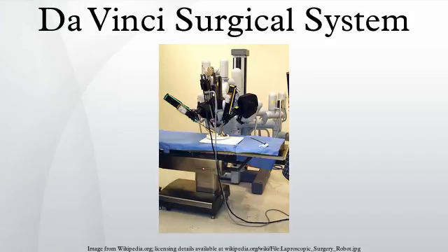Criticism. Critics of robotic surgery assert that it is difficult for users to learn and that it has not been shown to be more effective than traditional laparoscopic surgery. The Da Vinci system uses proprietary software, which cannot be modified by physicians, thereby limiting the freedom to modify the operation system. Furthermore, its $2 million cost places it beyond the reach of many institutions.